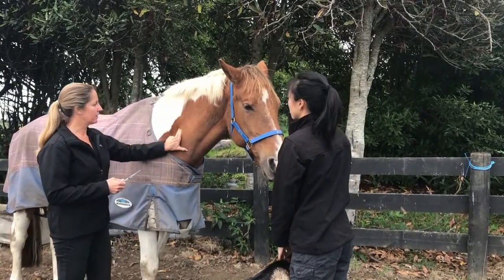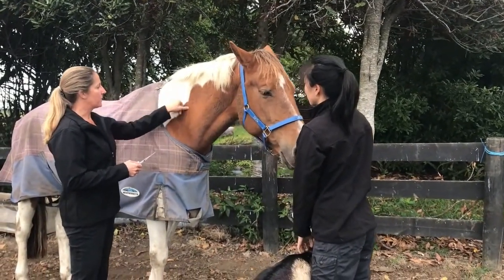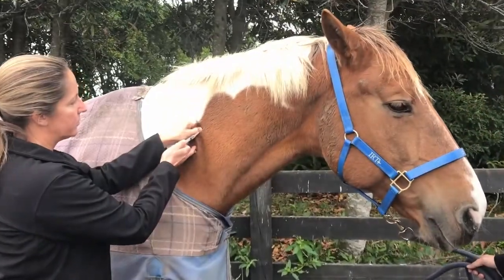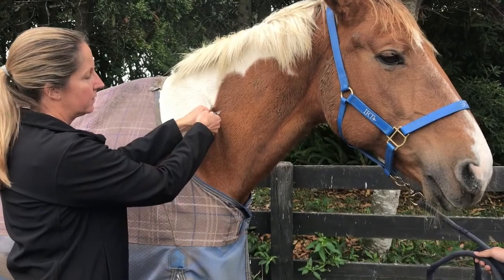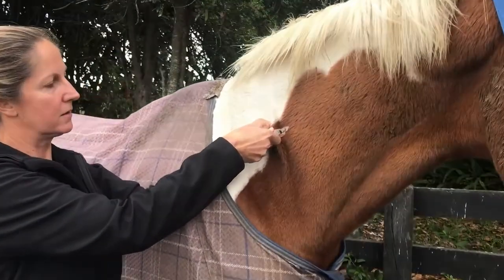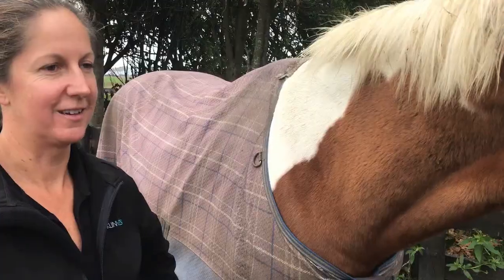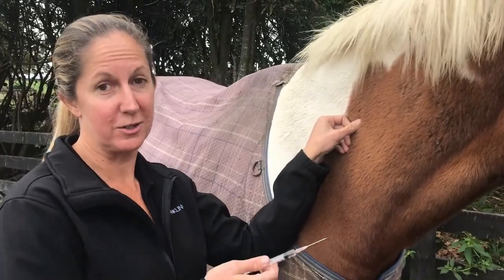Here we've got the cervical spine and our triangle. I give them a little pinch and go straight in with the needle all the way, then draw back — and we do have a little bit of blood, so I'll redirect. As you saw, getting a little blood is good to see what that looks like. We'll just go to a new spot.